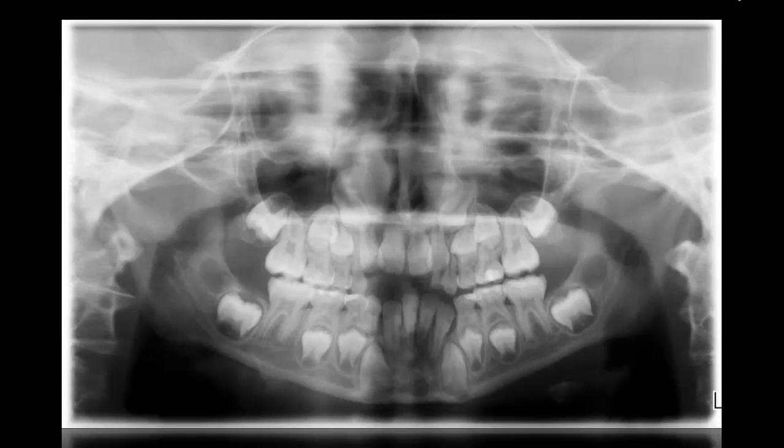Now, again, look at the position of the canines. What's good about the lower canines, mandibular canines? What's good about those that tells you this may not be as high of a risk of impaction? Okay, they're straight up and down. What's that? Exactly, yeah. So there you go.